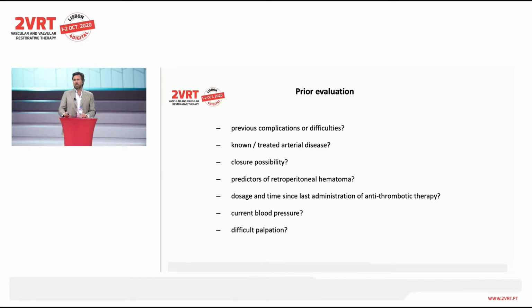As I was saying to you previously, it's important to know your patient. So you have to do your homework. You have to know if the femoral has been punctured, or if we're doing a transaxillary, if the patient has had any problem with the transect, any kind of complication, any kind of injury that would make our work much harder, and the results won't be that good. Is it possible to use this type of closure device or that type of closure device?